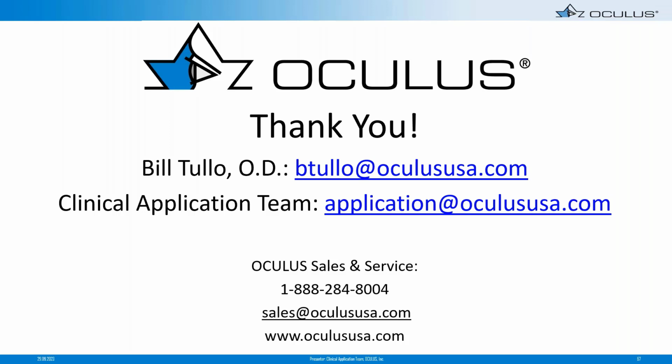And then unlike a surgical procedure, I think my tolerance for time would be a little bit less. So again, on a soft lens, maybe 24 to 48 hours out of the soft lens. On a rigid gas permeable lens or a hybrid lens, maybe a week out of that lens would be necessary to get a reliable screening measurement on the Belin-Ambrosio enhanced ectasia display. So yes, I wouldn't need to take quite as much time as if I was measuring for an IOL calculation or determining a surgical outcome.